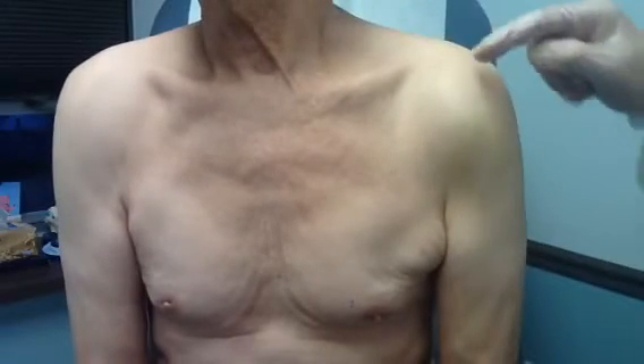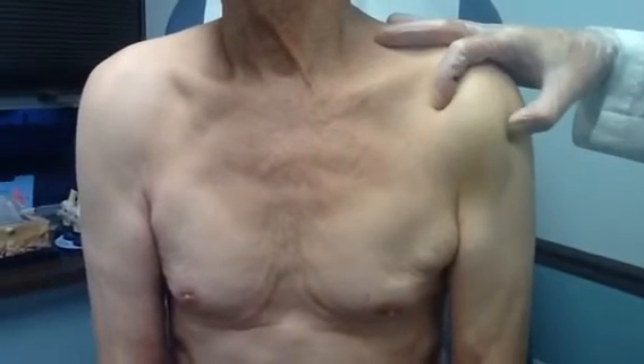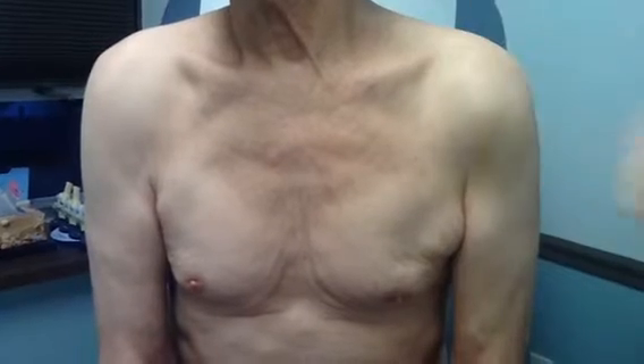Now we're going to do aspiration from the shoulder bursa. Looking at the shoulder here, this one is the normal shoulder — flat, muscle, deltoid, biceps normal. If we move to the other shoulder, we'll see the shoulder here is bulging. This is the bursa, all the way below the deltoid part.